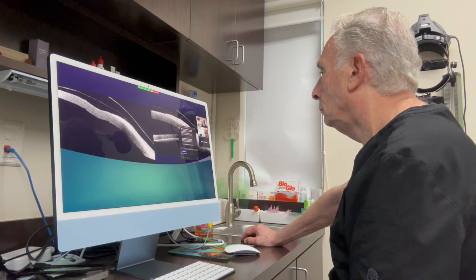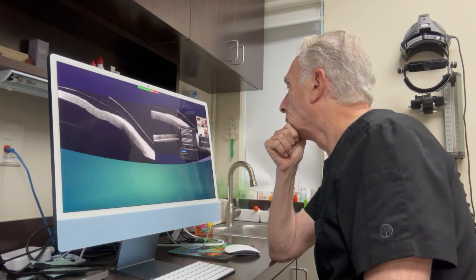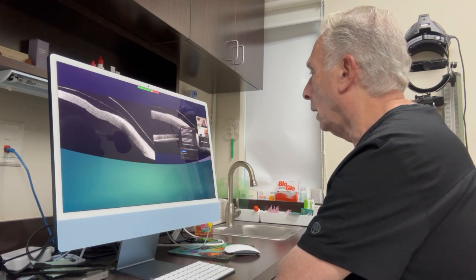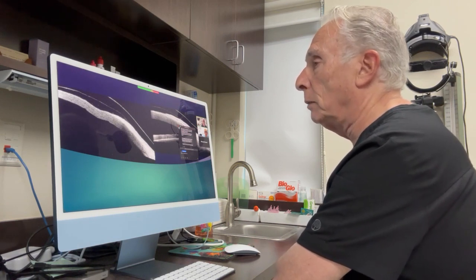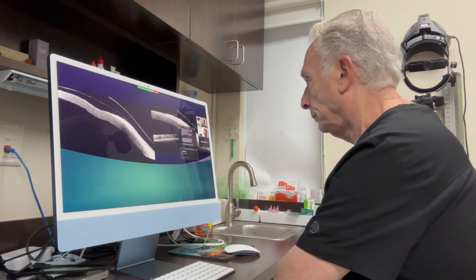Of course, after fitting lenses we still have some higher order aberration. Nevertheless, we are giving a much better image for keratoconus and ectatic patients than with spectacles or soft lenses. That's certain. I think the world is changing so fast that in 2 or 3 years from now, what we're talking about right now may seem like ancient history. But I think the changes are taking place faster, and better things are going to come along in the next year or 2.